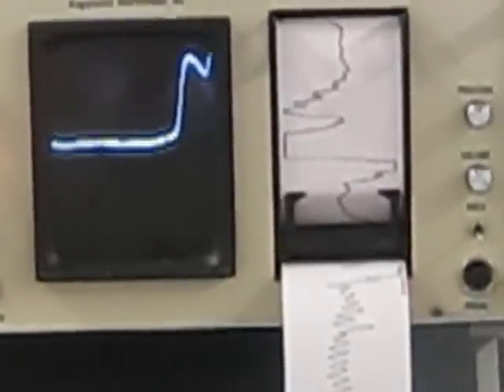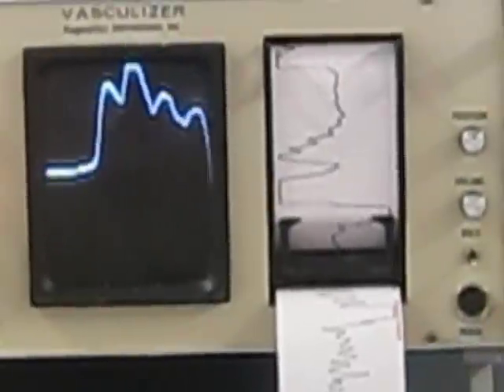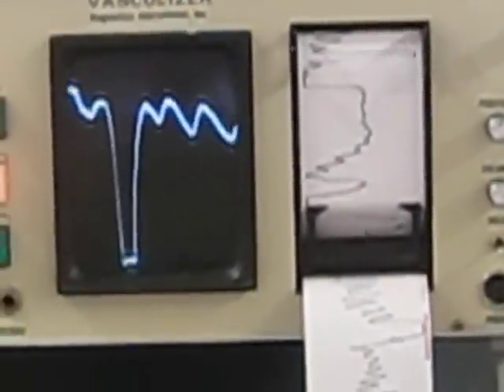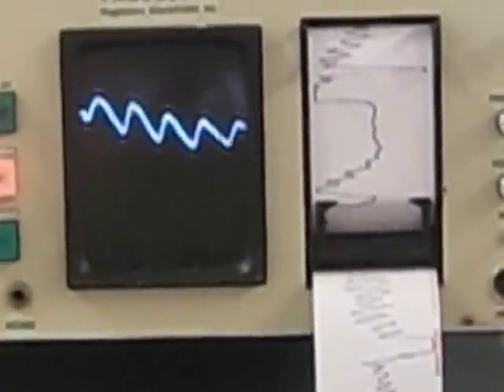Continue breathing. Put your hand back into your lap. And you notice almost immediately that the wave comes back in regular form and amplitude.